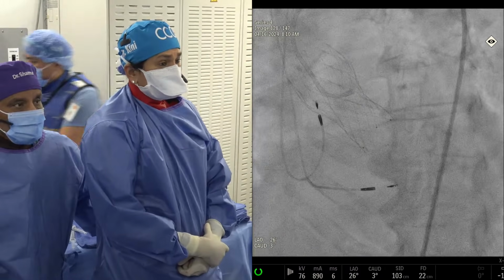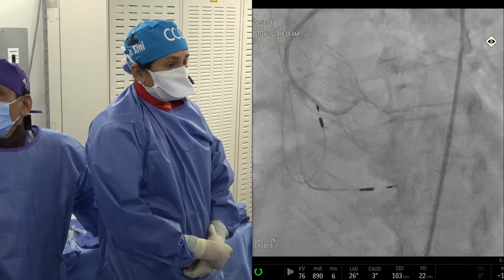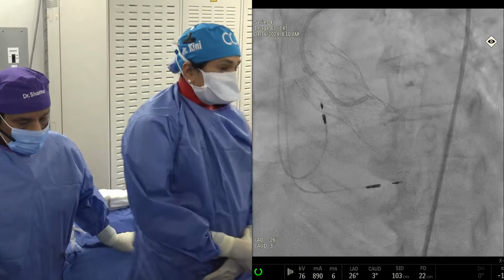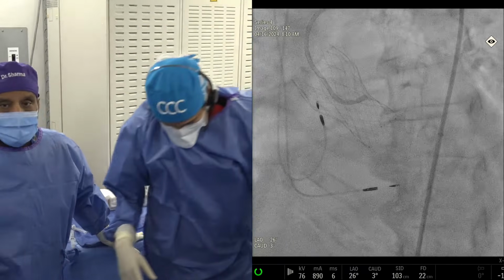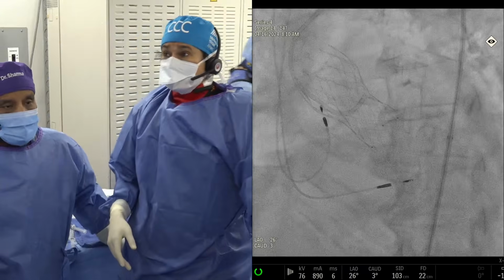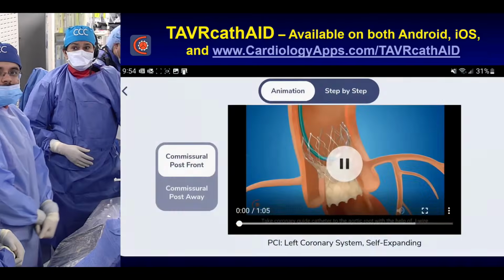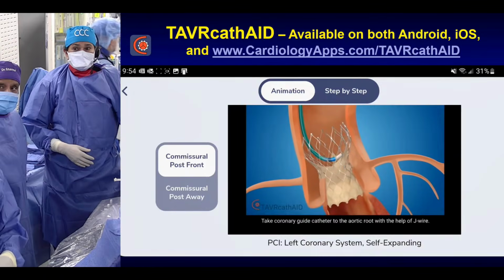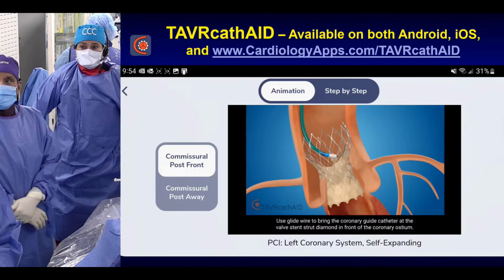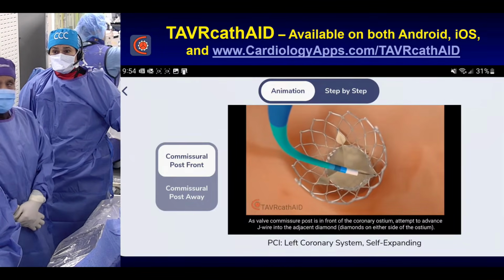So Anu, should these cases be done preferably via femoral access? It's difficult to say. Yeah, that's a very good point. So the question was, when we had the paper in JACC, we did have a letter to the editor. We emphasized these cases should be preferably done by the femoral route, but a lot of the radial gurus may do it by the radial, but preferably femoral, I would say, yes.